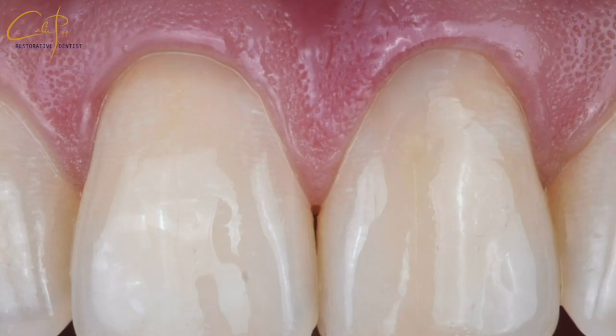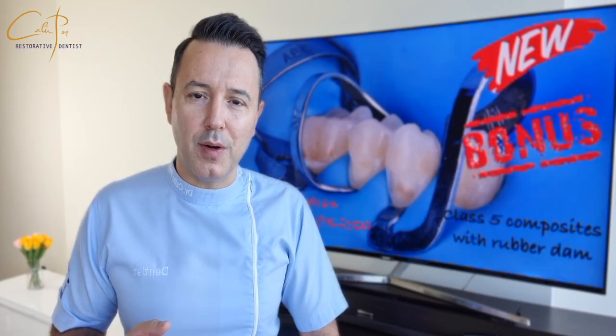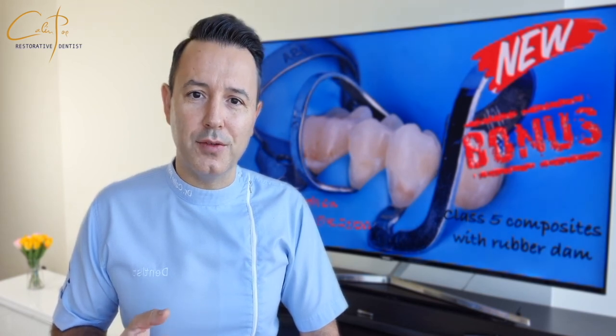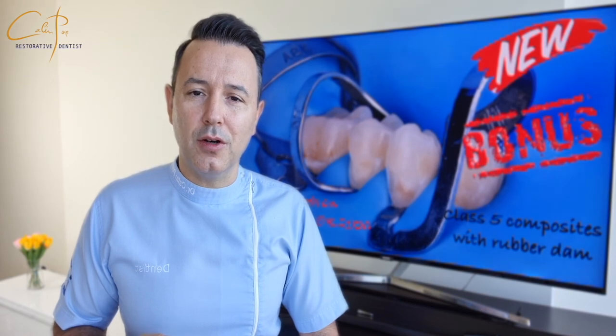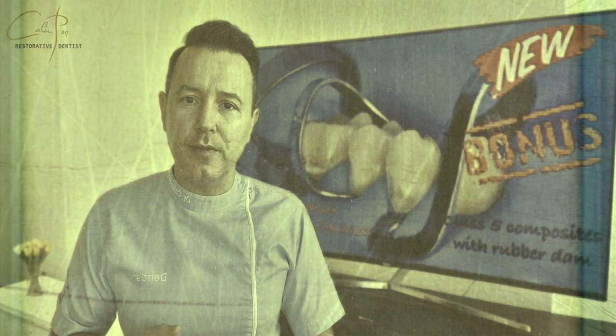This last photo is after one week. I hope that after seeing this video you will not perceive the integration of rubber dam isolation with class 5 composites as a hectic and frustrating procedure, but on the contrary, you can appreciate the ergonomics and all the advantages of this approach. The main purpose is the peace of mind when layering composites and the certainty that you are performing the adhesive protocols in a perfectly isolated area.